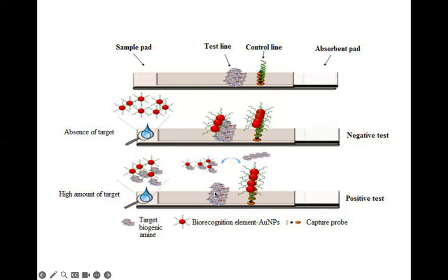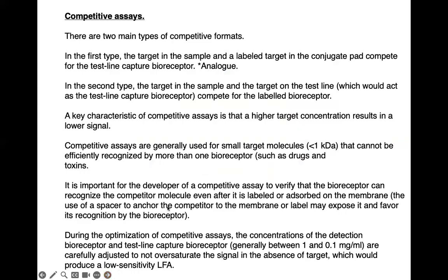I don't have any experience, and I don't know whether Dr. Hafiz has, but tomorrow we will introduce to you the non-competitive. But to my knowledge from the reading, competitive is more sensitive and uses less antibody compared to the non-competitive. All right, so competitive assays are generally used for small target molecules.